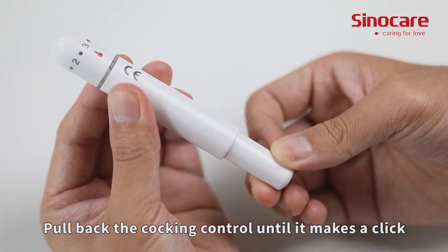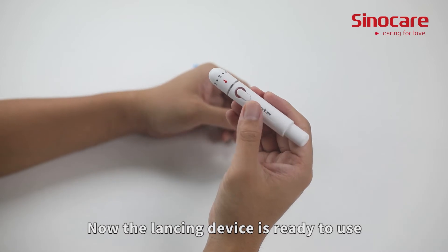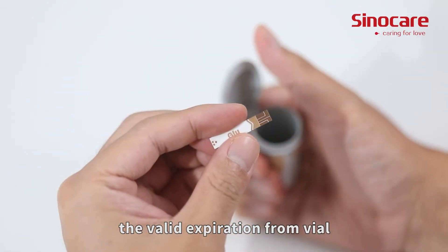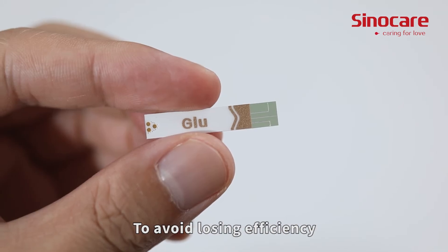Pull back the cocking control until it makes a click, and then release. Now the lancing device is ready to use. Remove a new test strip within the valid expiration date from the vial. After taking the strip, immediately cover the vial to avoid losing efficiency.